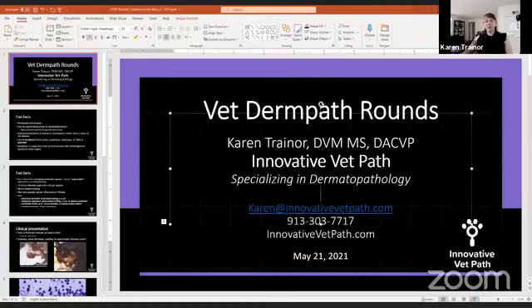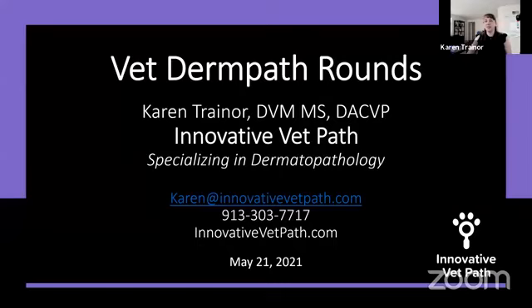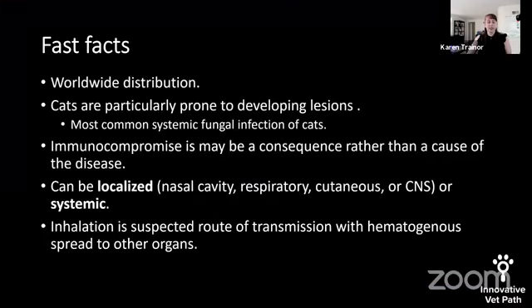I'm going to share my screen so you can see what I'm going to be showing today with this case. We're going to cover a case of cryptococcosis, and we're going to see some different examples of that, and I'll share that with you. Just some quick facts right off the top.